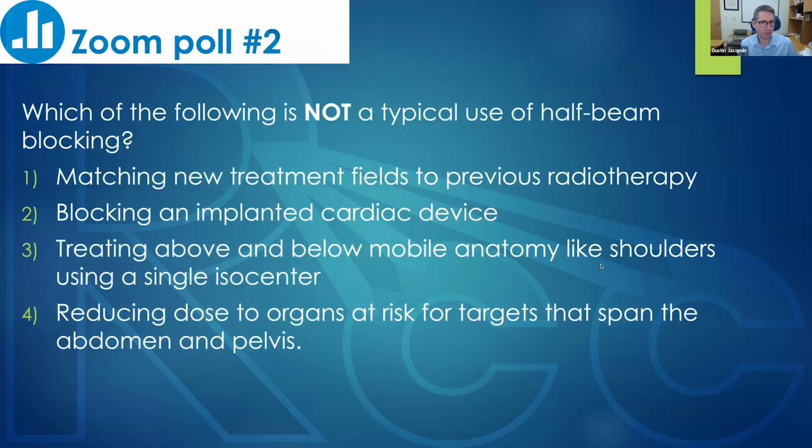Which brings us to our second poll question. Which of the following is not a typical use of half beam blocking? Please enter your answer in the chat.